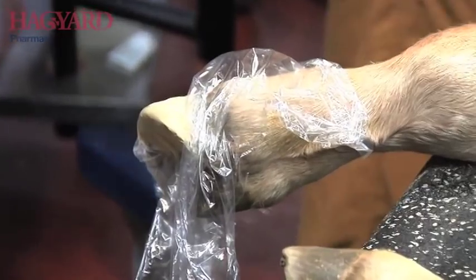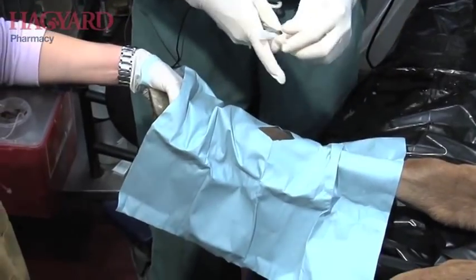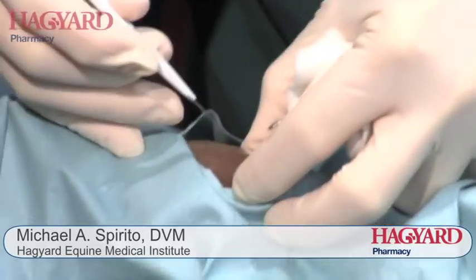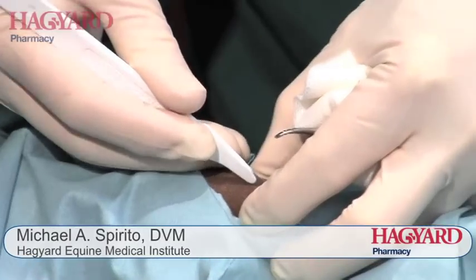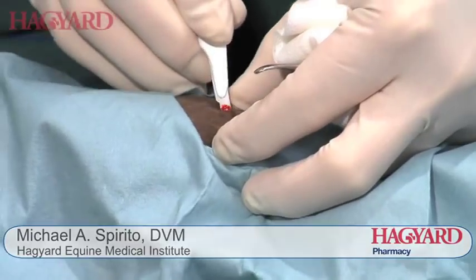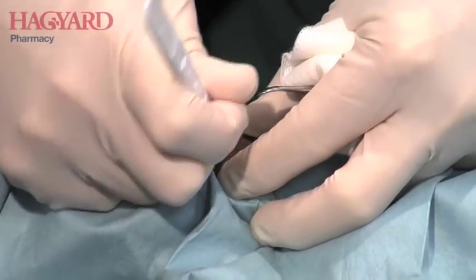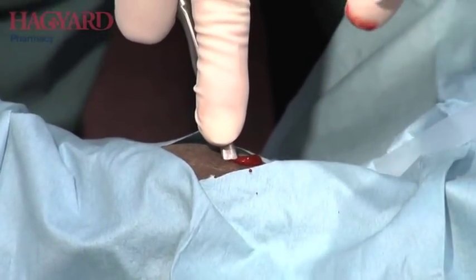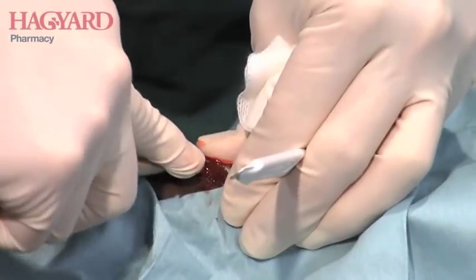Then we'll do the periosteum elevation in a second. What we do is incise the skin and the periosteum at the same time on the first incision. The growth plate is right here. I'm going to go just above the growth plate, stick my scalpel in, go underneath the skin, pull down a little bit just above the growth plate, then tunnel underneath it, cut the periosteum again, come back, cut the periosteum one more time, and now I'm going to lift the periosteum — putting the scalpel out of the way so I don't cut myself. And there I'm lifting the periosteum.